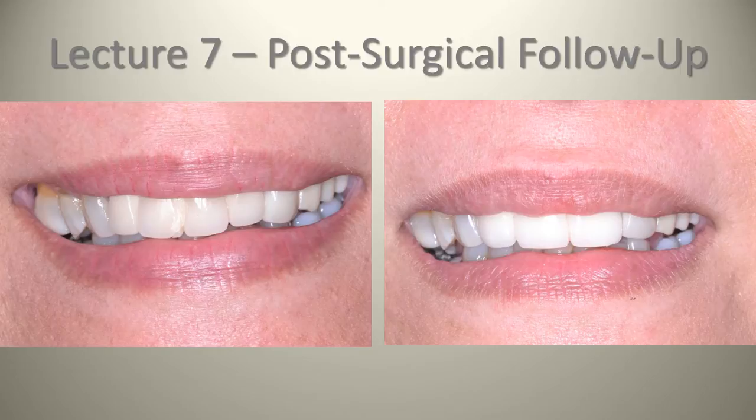In Lecture 7, we talked about post-surgical follow-up. We had that patient who had the failed maxillary anterior bridge, and she had a bit of a mutilated dentition in the sense that she had lost some teeth prematurely. You can see this prosthesis in the picture on the left. The midline had been shifted and she wasn't very happy with it. The cosmetic outcome wasn't really what she had sought out.